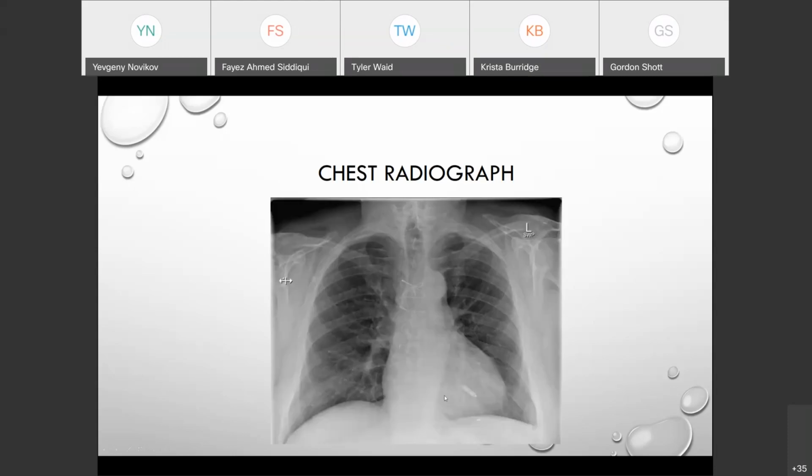And this is a trick question here, but obviously there's no can in the patient's chest, but always be mindful here. You can see that there's something odd down here. This is actually one of the Micras, so it's sitting down here in the RV apex, clinging to one of the trabeculations. Again, this is going to be sensing only ventricular activity because you have nothing up in the atrium. It's only going to be able to pace the ventricle because you have nothing up in the atrium as well. Right. I don't see any questions coming through on the chat, which sounds good. We can keep going then.